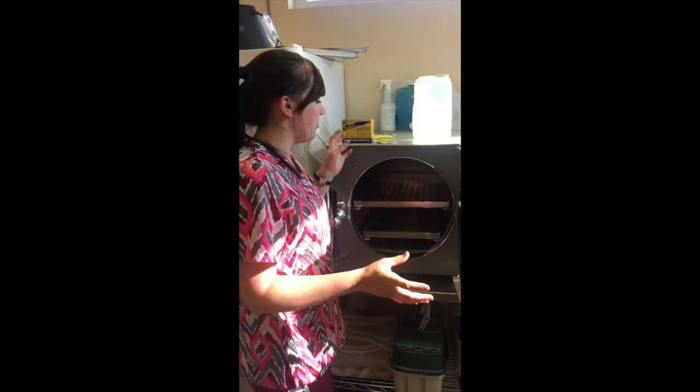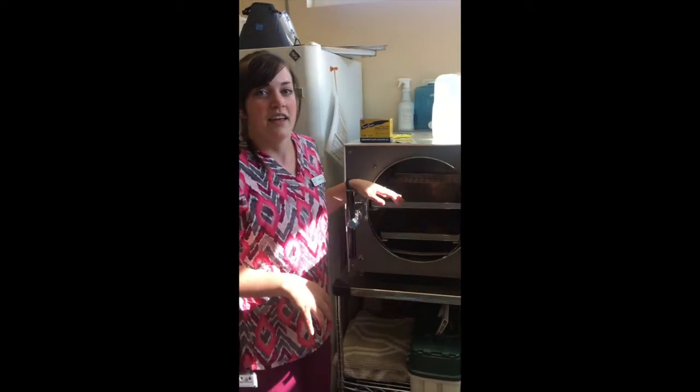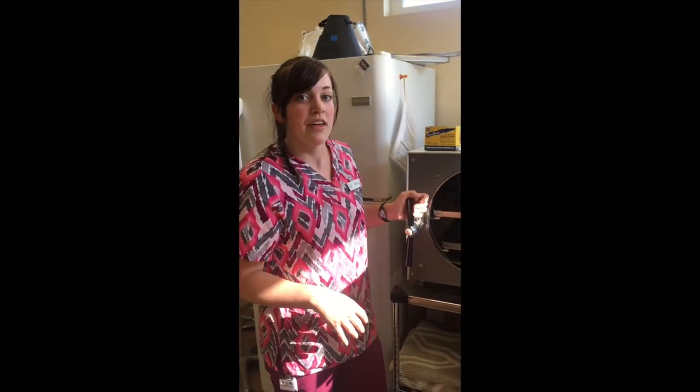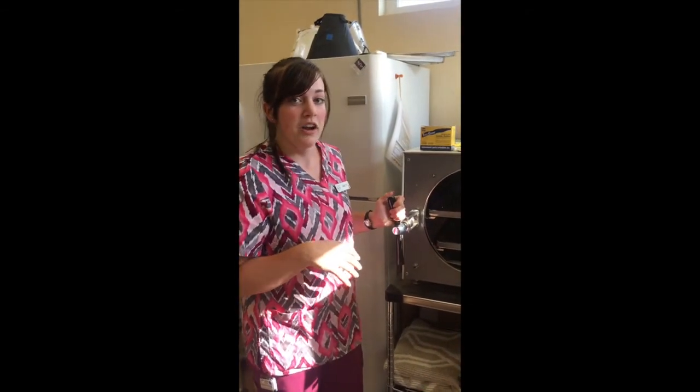Once that's done, we drain all of the water again, and we wipe the entire inside down with another lint-free cloth, and we fill it up with brand new distilled water, and it is ready to go, and that's how we maintain our autoclave.